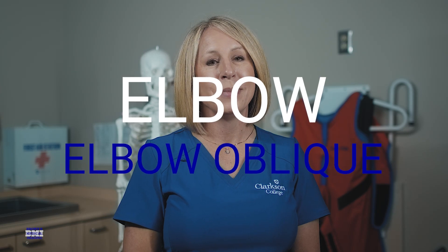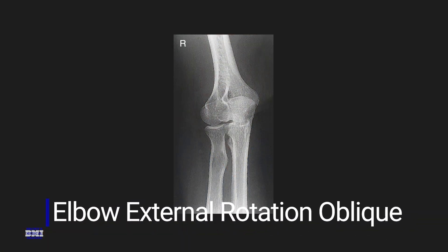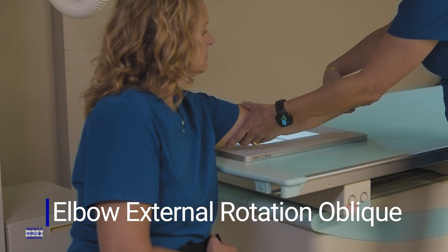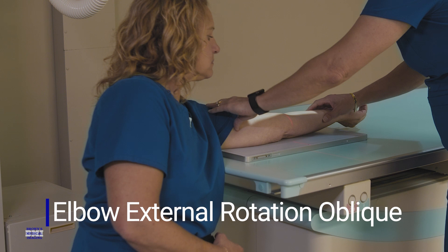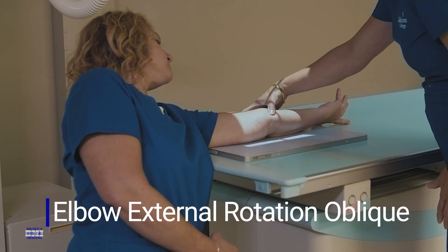Obliques of the elbow. They're another area that can be very difficult to position, especially for the patient. I cannot stress enough though, when you do an oblique of the elbow with an external rotation, you have to ensure that the shoulder, elbow, and wrist are on the same plane. The elbow must be rotated externally about 45 degrees.